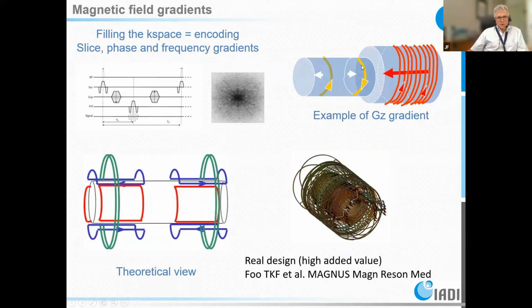And this gradient coil is inserted into the main system here. This means that when you have a sequence, you can apply some magnetic field in X, Y, Z. Just this was the Z magnetic field here. So you can do some encoding. You have probably seen this in several courses before. In an MRI, you have X, Y, and Z coils here. The green is the Z magnetic field. Here the Y magnetic field in blue, and the X in red.